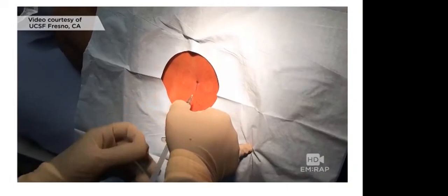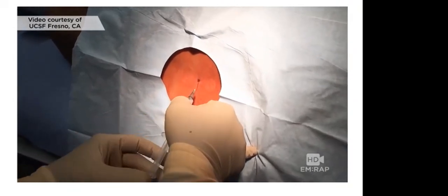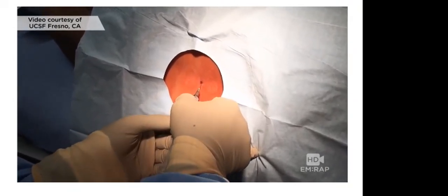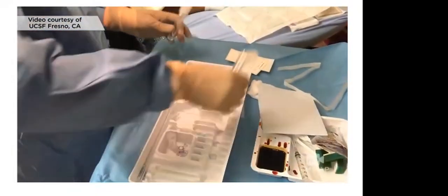Anesthetize the skin with a wheel and then the subcutaneous tissue in the tract that you're planning to pass the needle, and we hope we're right. We know we may have to redirect. While that anesthetic is taking effect, you can get ready, set your tubes up and your manometer if you're going to check an opening pressure.